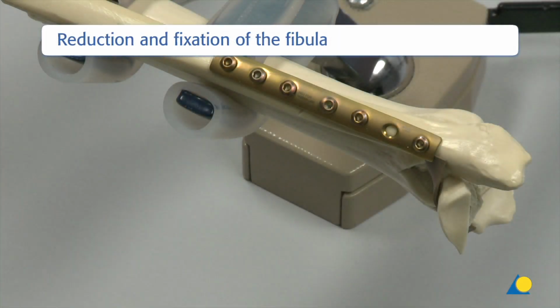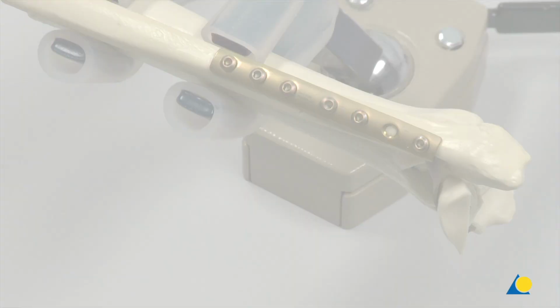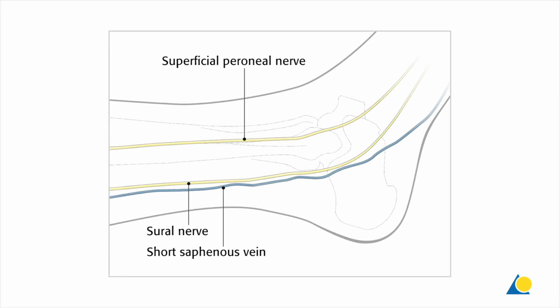The first step is the reduction and fixation of the fibular fracture. The standard approach is a longitudinal lateral incision. A 10 to 15 cm straight lateral incision is made in line with the fibula.